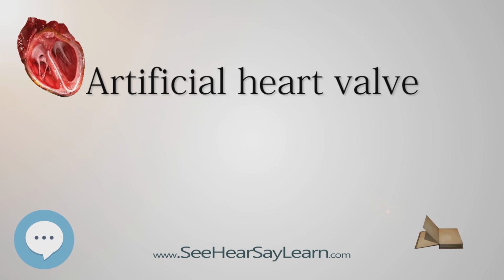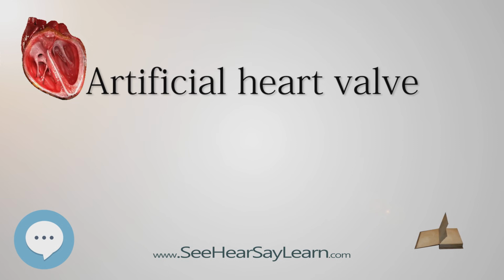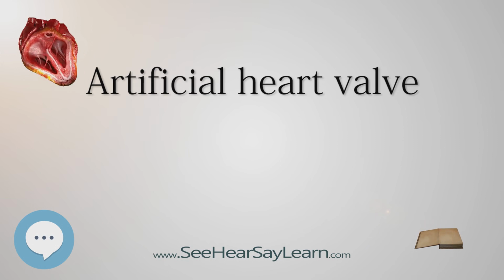Even dislodged fragments from uninfected thrombi can be hazardous, as they can lodge in, and block, downstream arteries, e.g. coronary arteries leading to myocardial infarction, cerebral arteries leading to stroke, see embolism. A desirable characteristic of heart valve prostheses is that they are non or minimally thrombogenic.